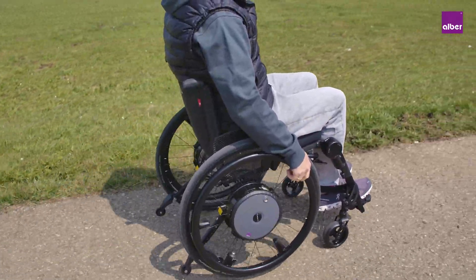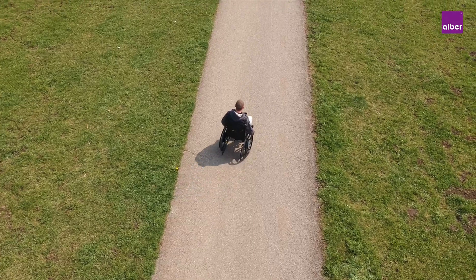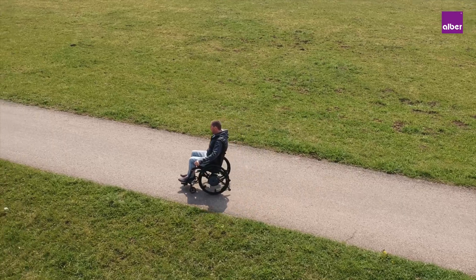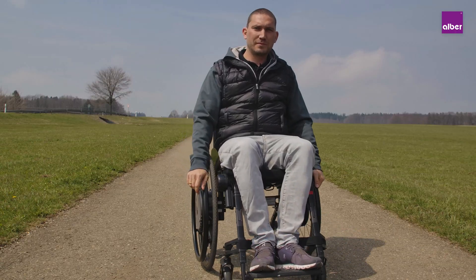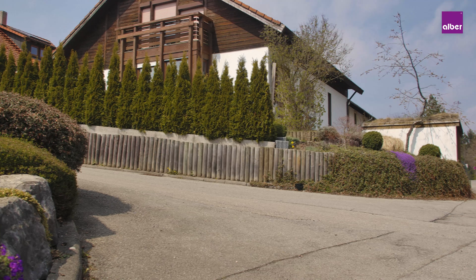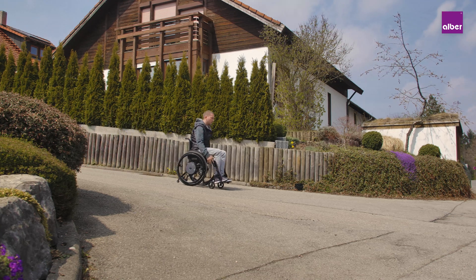The Duo Drive will maintain a permanent speed. All you have to do is steering with your push rims — the drive wheels will do the rest. This is ideal for longer distances or when going uphill. You can also reduce the speed on the control unit while going downhill.